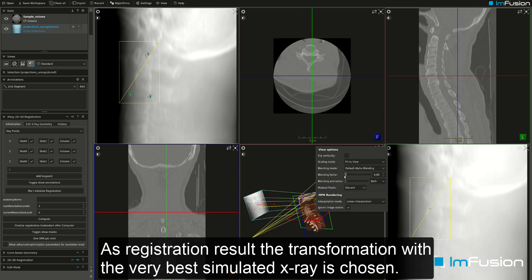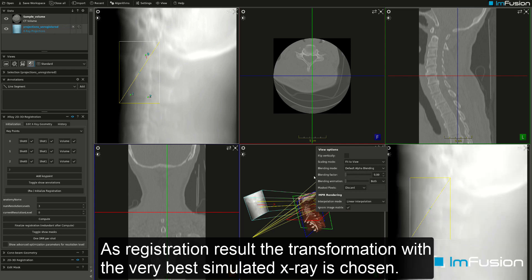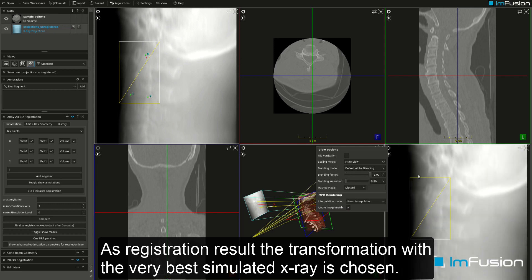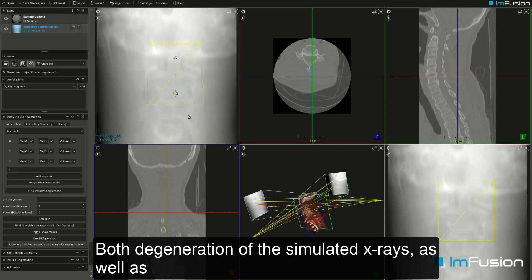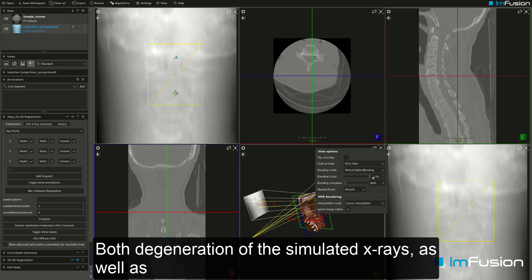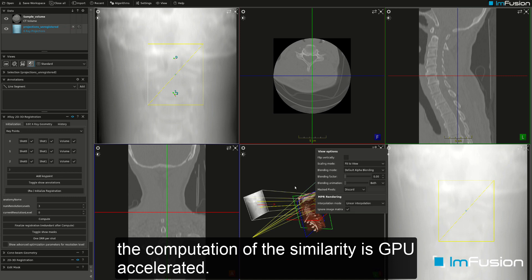As the registration result, the transformation with the very best simulated x-ray is chosen. Both the generation of the simulated x-rays and the computation of the similarity are GPU accelerated.